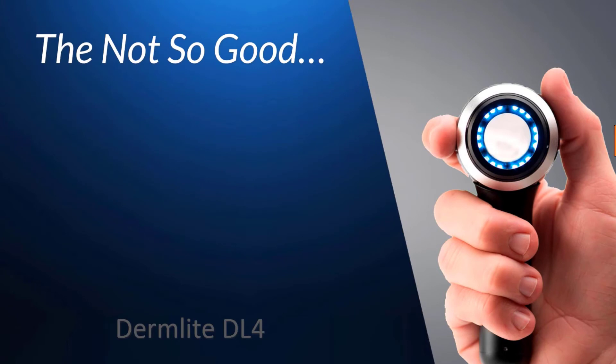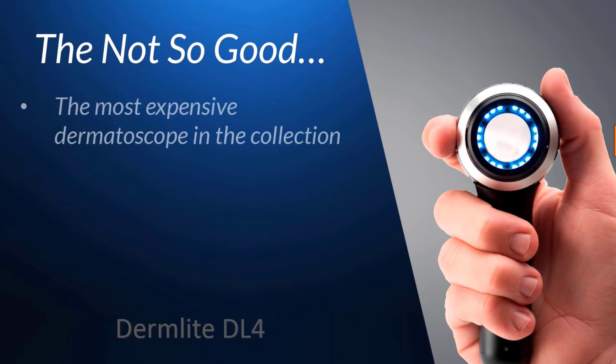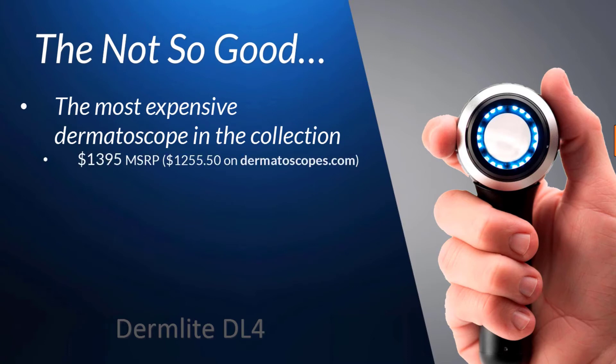So what's not to like? Well, just being honest, for many people it's the price. It's the most expensive unit we're reviewing here, with a suggested retail price of $1,395. But as with the other dermatoscopes, on our website we do offer them for a fair amount less. But discounted or not, it does take a little getting used to when you haven't yet purchased a high-end dermatoscope whose price tops out over $1,000.